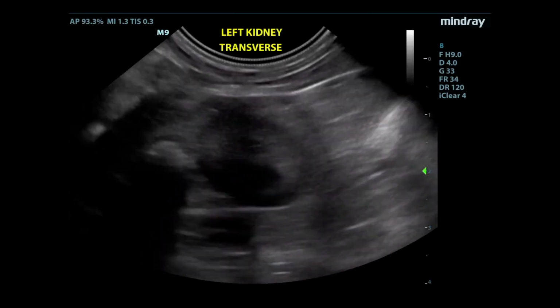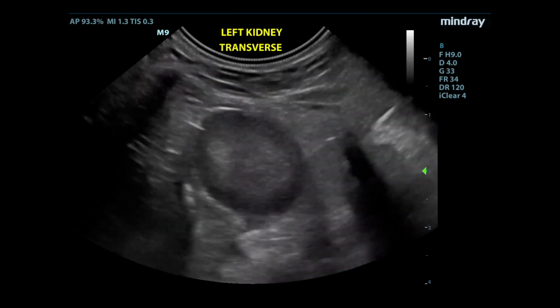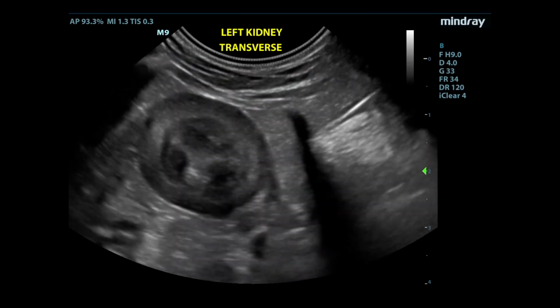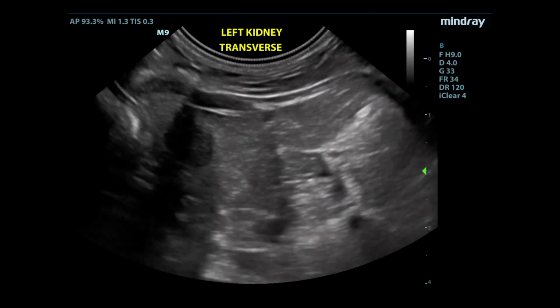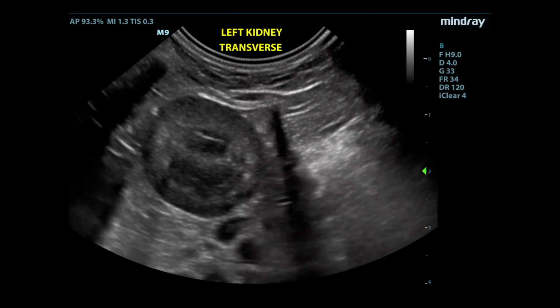In a lateral transverse or ventral transverse view, the left adrenal appears as a nodule that increases and decreases in size as you slide or fan the transducer cranially or caudally. Using cinematic loop, review your images and measure adrenal diameter or width at its widest point.